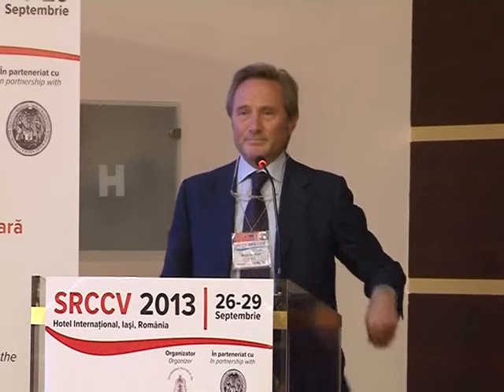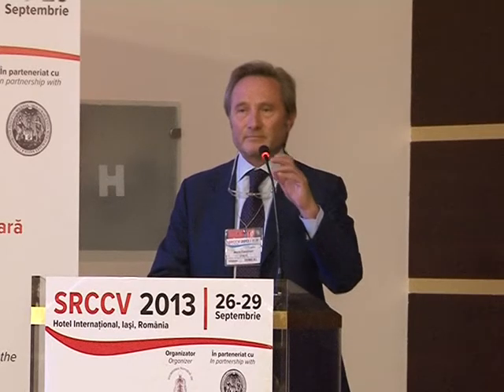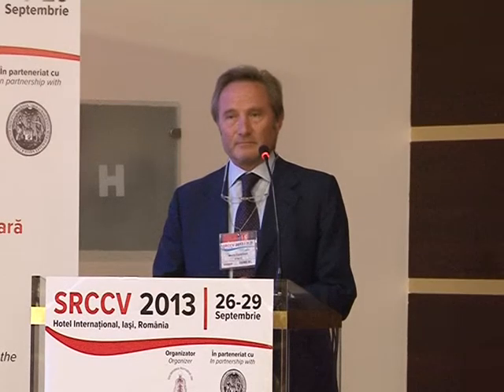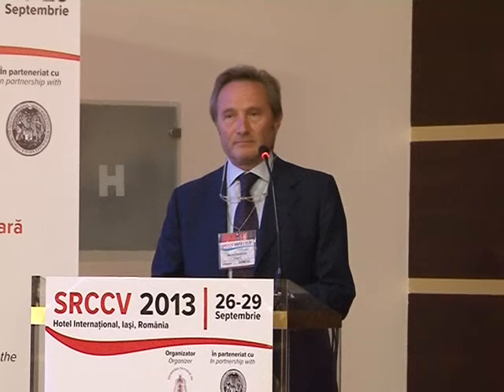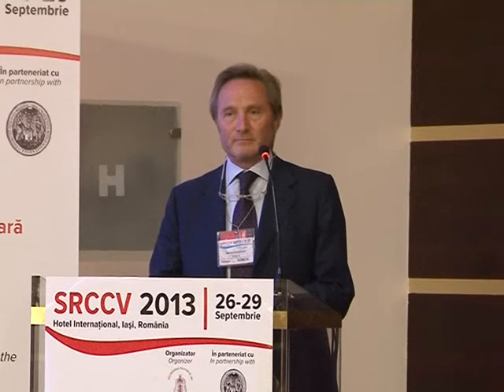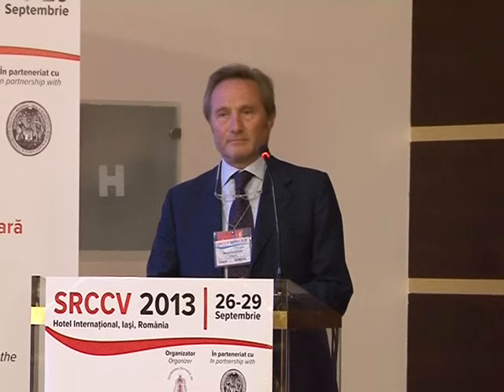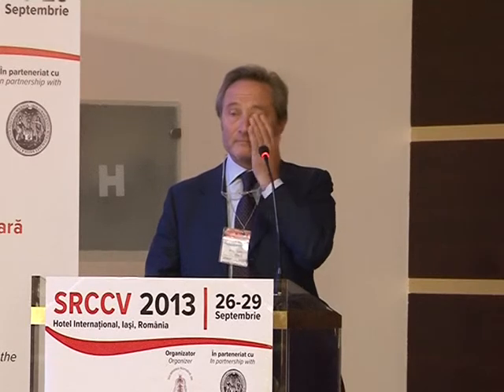Yes. Thank you for the beautiful presentation. We all know that you have the biggest experience in Europe. As you mentioned, more than 60% of these cases are with tetralogy of Fallot or pulmonary atresia with VSD. So one of the main problems for the surgeons are the reoperations for this type of patients, because as you mentioned, the right ventricle is right under the sternum, so the risk of bleeding is very important. So this type of procedure is important, but we have a lot of patients with transannular patch. So do you think the transannular patch is a limitation, or is there some possibility for tetralogy of Fallot?